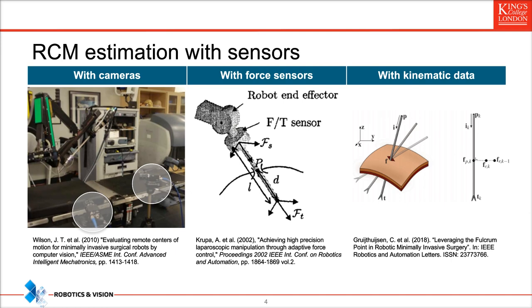The third picture shows the use of robot kinematic data to estimate the RCM position. Normally, using these kinds of methods, the intersection points between consecutive instrument axes are found, and the distances minimized between all the recorded poses. The issue is that these methods do not factor in the use of different sensors for the instrument position and orientation, as found in passive wrist RCM systems. Noisy orientation sensors produce greater estimation errors.